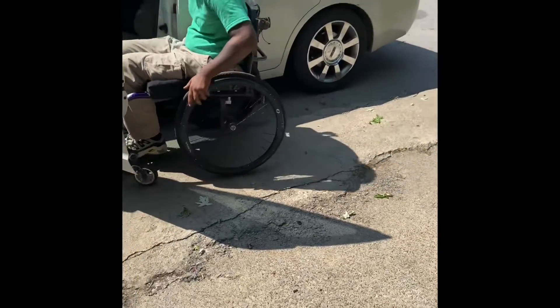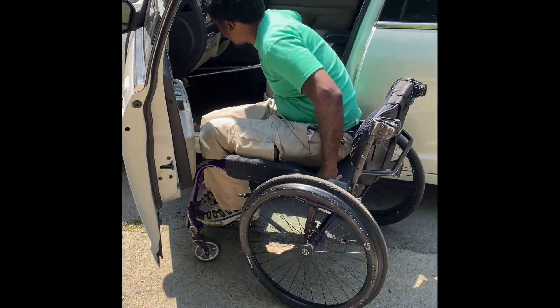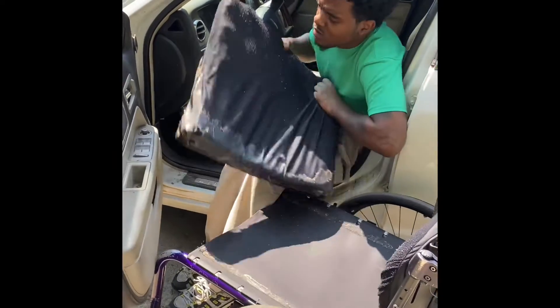First I roll up, lock my wheels, and then I use my arms, I push up, lift my butt up, and I transfer and I lead myself over into the driver's seat of the vehicle.